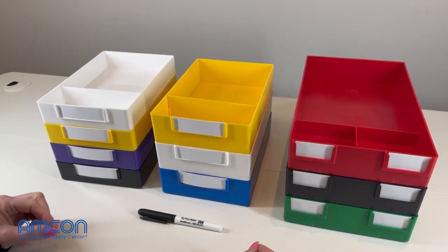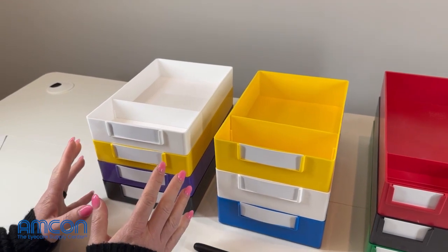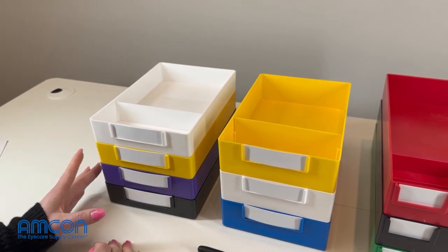Here we have our job trays displayed. We're going to start with the standard job tray. This is going to be one that's most commonly used in an office setting for patient orders. We've got the white, yellow, purple, and black displayed.